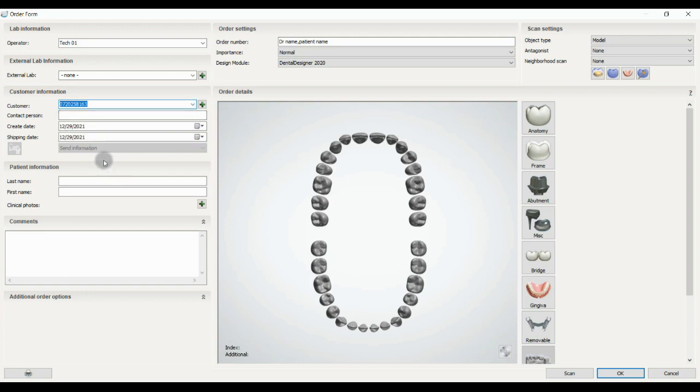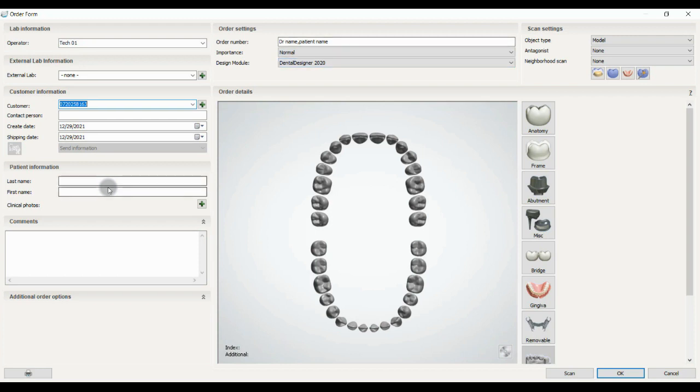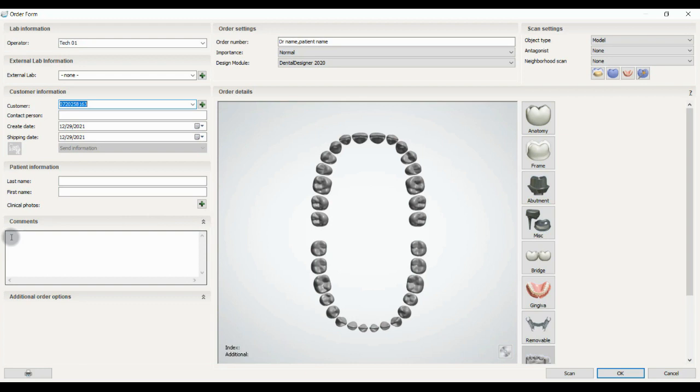Next one is patient information, where we can put the first name, last name, and if he or she had any clinical photos we can import from here. And if we have any specific comments on this work, we can write it in here.